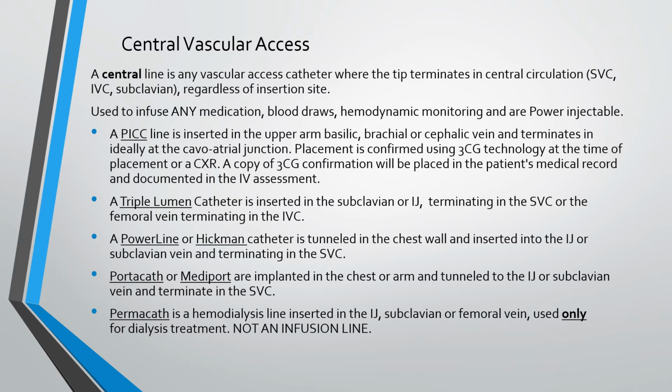Central vascular access. A central line is any vascular catheter where the tip terminates in central circulation, the SVC, IVC, or subclavian vein, regardless of the insertion site. They are used for infusion of any medications, for blood draws, hemodynamic monitoring, and power injecting of contrast medium.